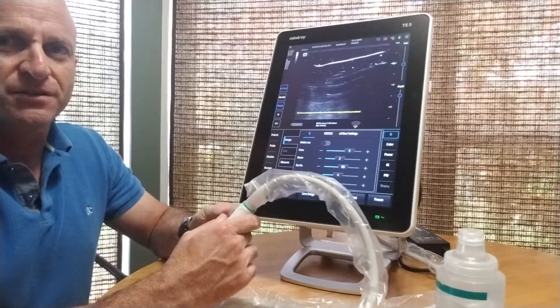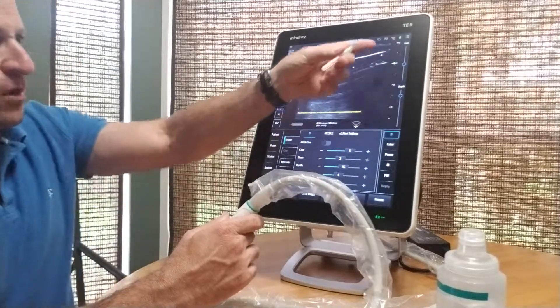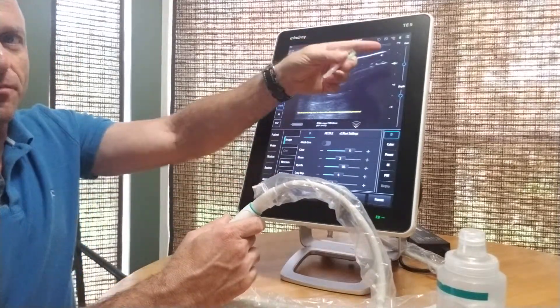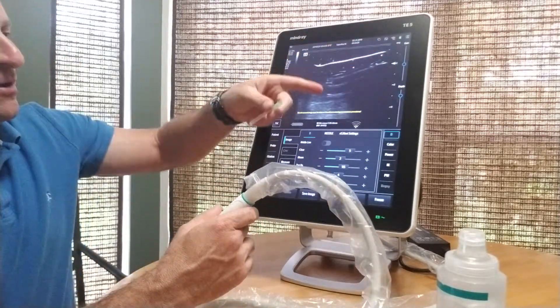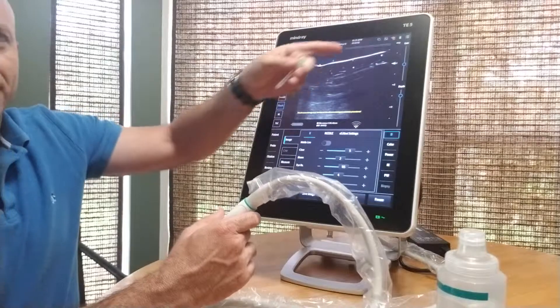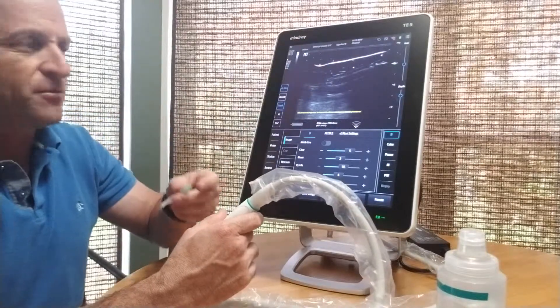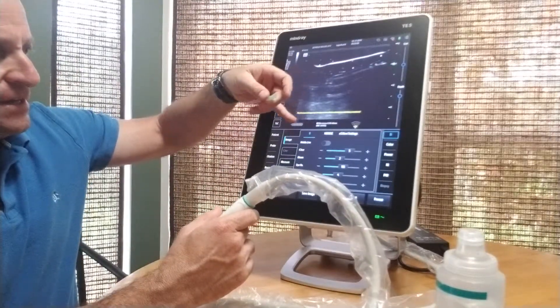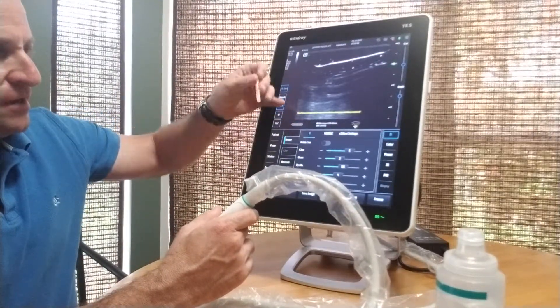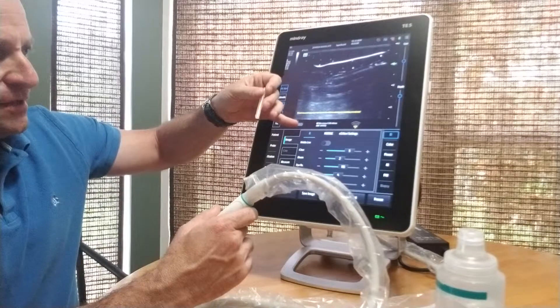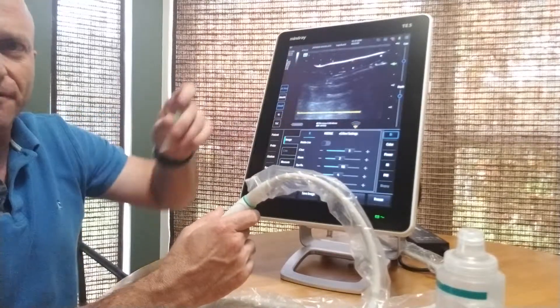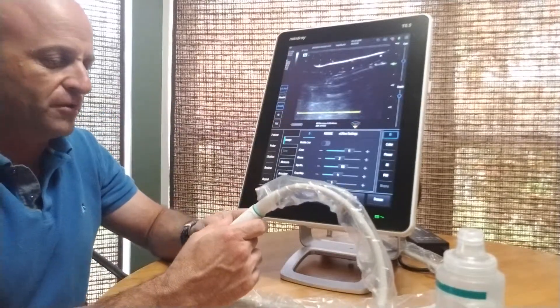Now as we're positioned with the patient, if you watch up on the screen, we're going to have an approach coming from this side of the representation of the needle. This is also based on your orientation, and then you're going to have the angle of the needle over here.